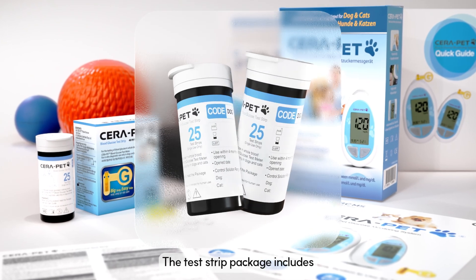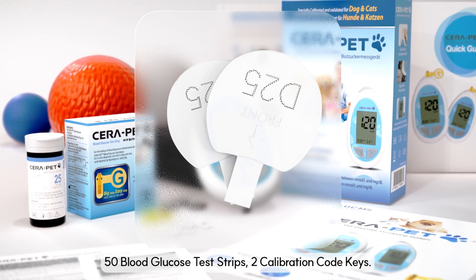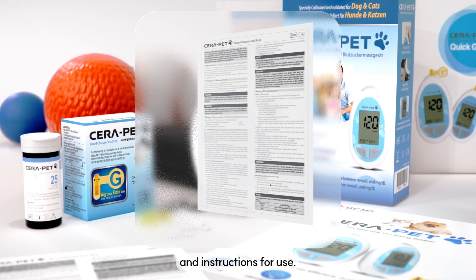The test strip package includes 50 blood glucose test strips, 2 calibration code keys, and instructions for use.